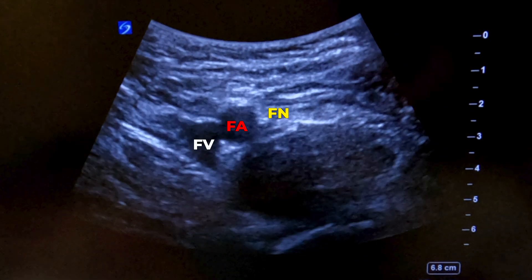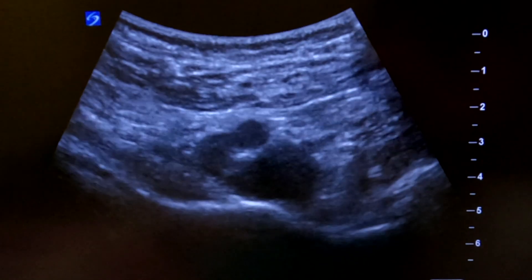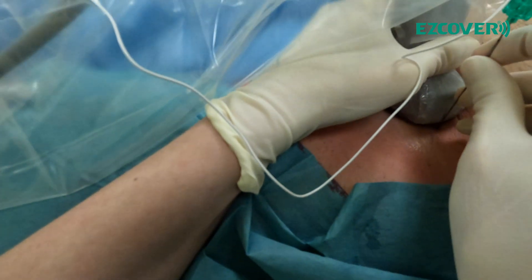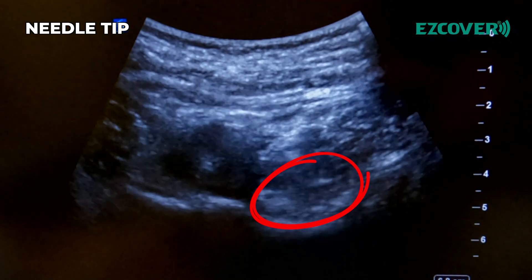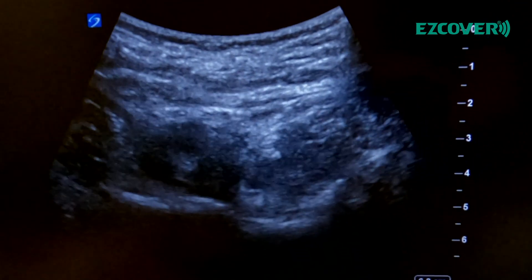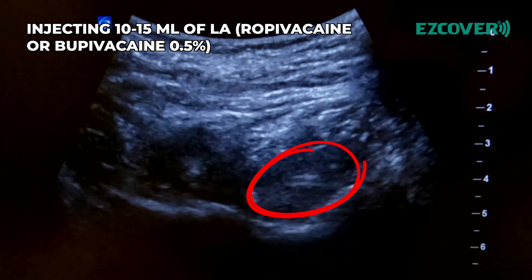Here we are identifying the artery and the nerve. Go slightly higher up, slightly more lateral. Keep going — aspiration negative. Perfect. Aspiration negative. Perfect. Aspiration negative.